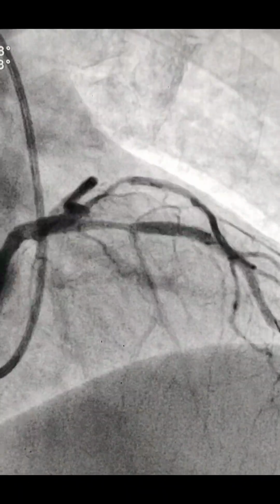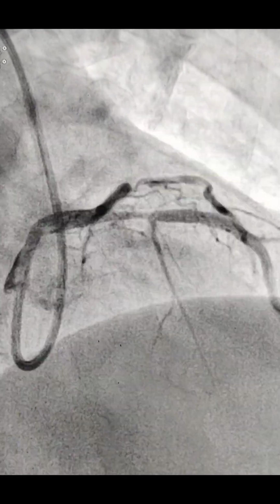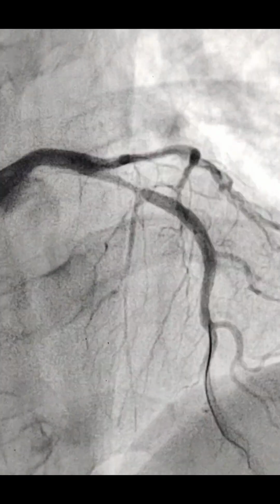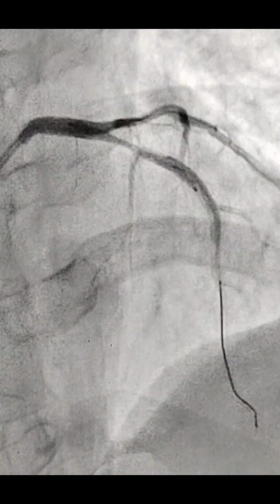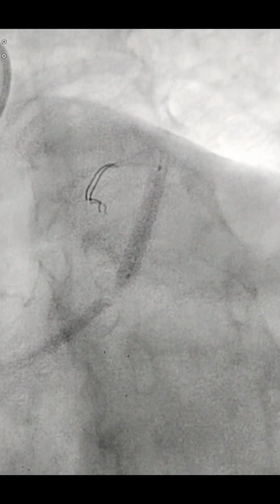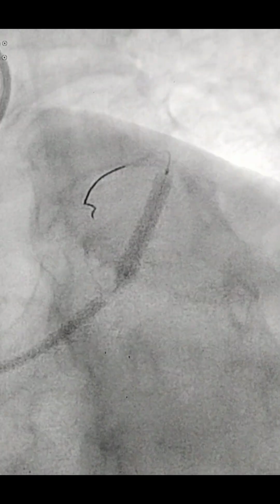The stent, you can see, is 3.5 by 30. This is the RAO cranial view. I think there was no need for lesion preparation because the lesion was 70%, and it may be a fibrotic lesion in the LAD, fibrocalcific, minor calcium may be there. So I did not do any predilatation. Now the stent is being deployed. The stent was 3.5 by 32 and was deployed at around 14 atmospheric pressure. The RBP was 16, nominal was 8.